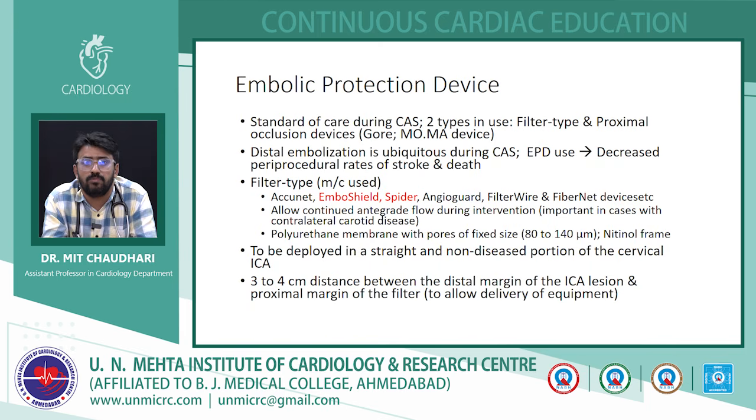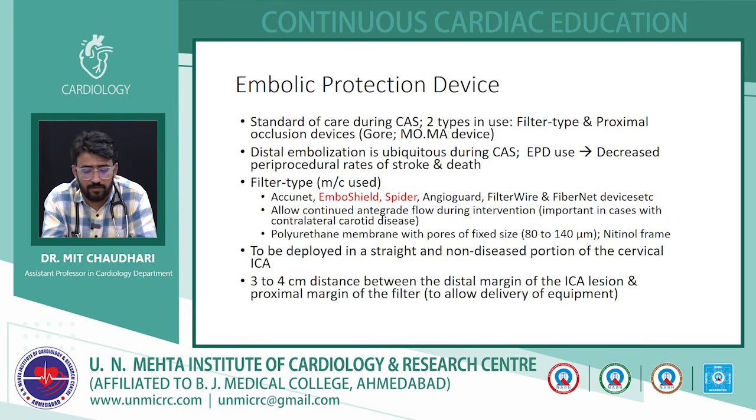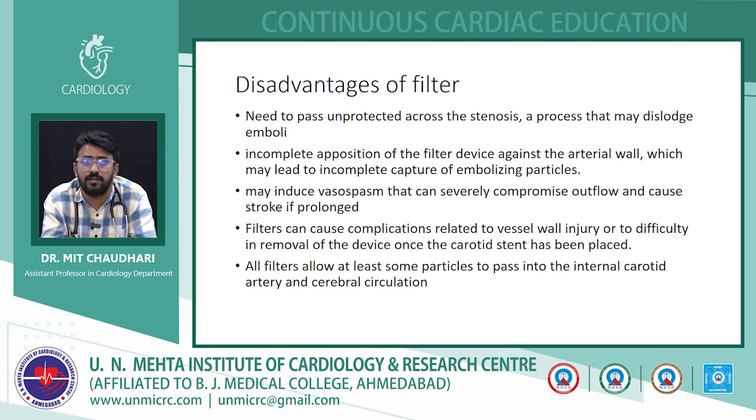It should be deployed in a straight portion, not very tortuous, and a non-diseased segment of the cervical portion of the internal carotid artery. Usually it is 30 to 40 mm from the lesion site. The disadvantage of the filter is that many filters, like the EmboShield, come with their own guide wire, a bare wire, with which we cross the lesion first, then we cross the lesion with the undeployed filter, and then we deploy the filter distally.